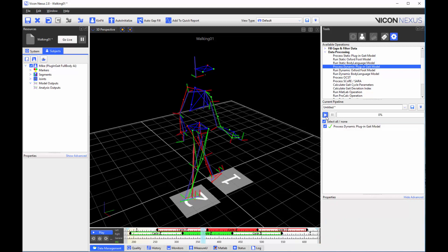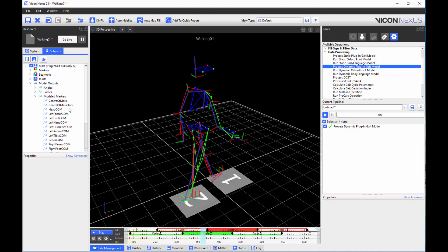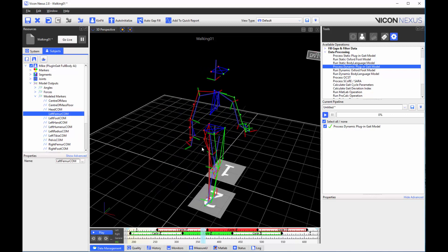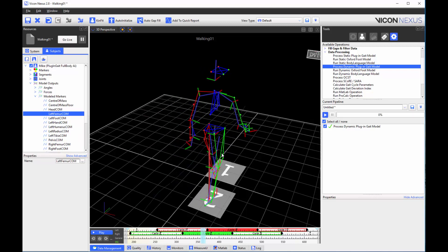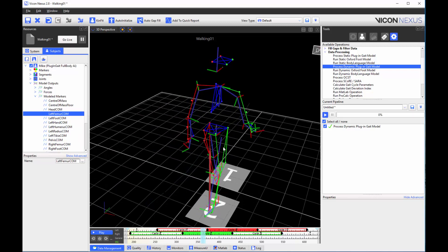Run the operation. I can now see the segment centers of mass in the modeled markers section of the model outputs. I can also see them in the 3D workspace.